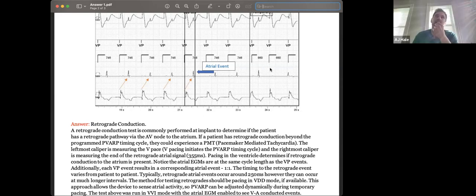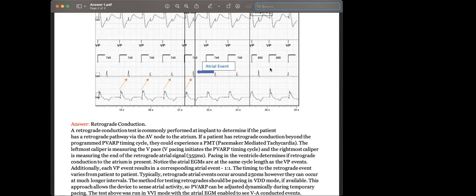Interesting. Yeah. So Jarrad, have you seen that? No, not off the top. I remember back in the day, Medtronic would always have greater than 254 PMT episodes. It was this random number that it stopped at 254 for some reason, but I'm not actually sure what the algorithm is to determine when the pacemaker thinks it's PMT as opposed to just a sinus rate, whether it's the same rate over a certain time.